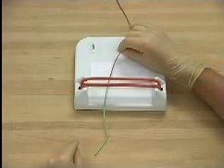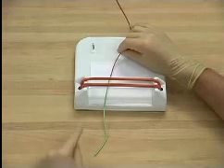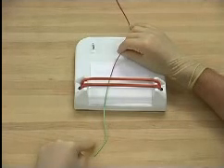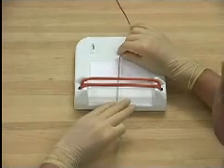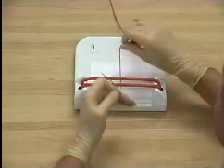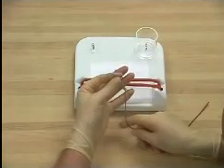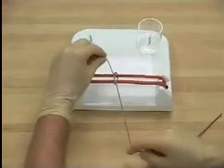This knot will be repeated, with the free end of the ligature or the suture pointing towards the surgeon, and the needle end away from the surgeon. The pick-up is again important, using the index finger and thumb, with the hand fully pronated, the wrist is supinated, the free end is crossed over the fingers, and again delivered into the fingers of the holding hand.